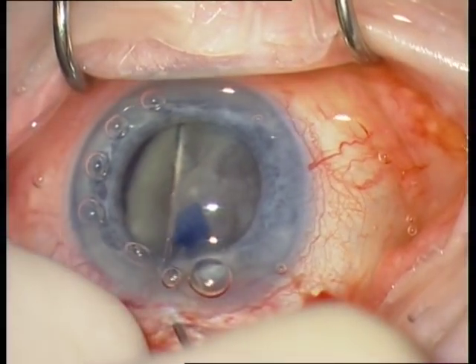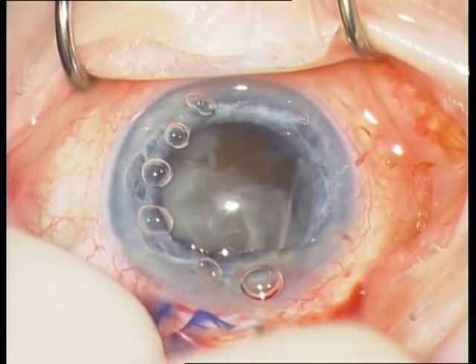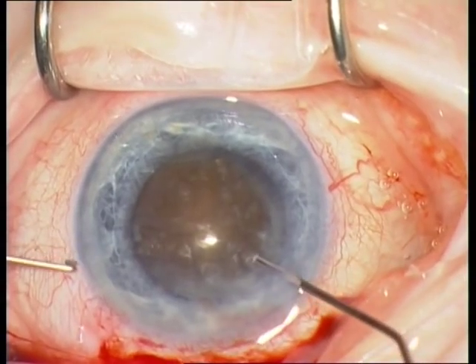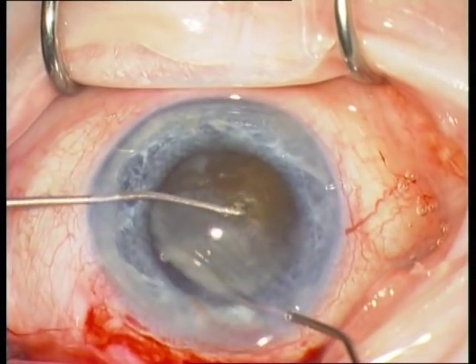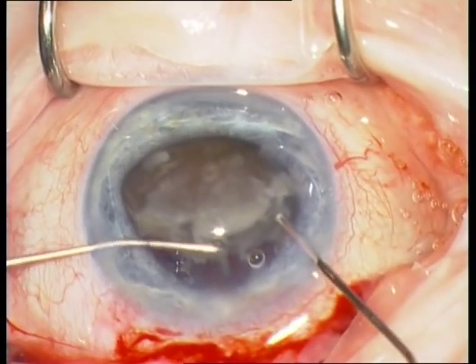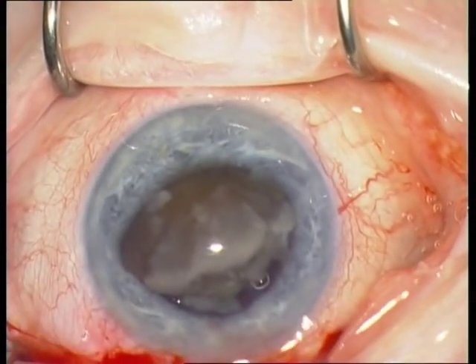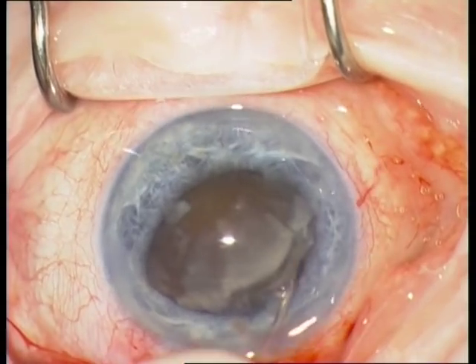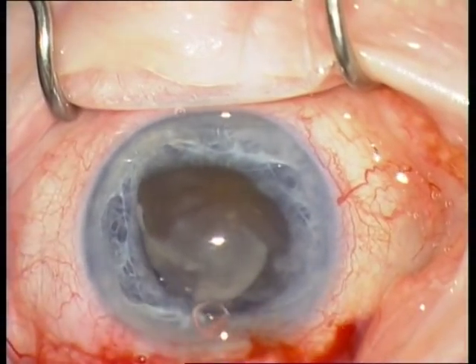If the rhexis is big enough, the lens will luxate into the anterior chamber. The nucleus can be rotated, but if the lens does not luxate into the anterior chamber, you have to luxate it mechanically — left with the manipulator push-pull and right with the viscoelastic cannula. Luxate the nucleus up and inject viscoelastic inside the lens capsule. This is important in order to prevent damage to the posterior capsule. Inject viscoelastic below the nucleus, and now you can luxate the nucleus into the anterior chamber without risking damage to the posterior capsule.